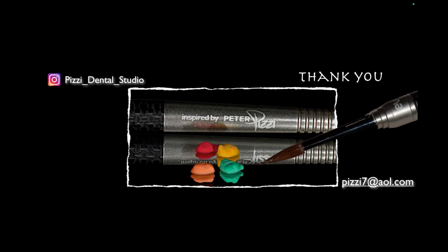Because today's world is much different than a long time ago. We have different materials, monolithic stuff, zirconia, PFMs. We have CAD/CAM blocks that we mail out. And like always, instead of just taking a prescription and doing what's asked, a technician's responsibility still should be to look at it and communicate with the dentist. The truth of it is it was easier kind of in the past, right?